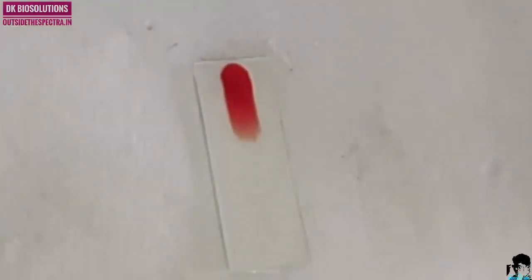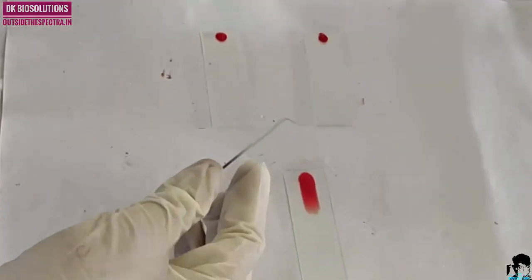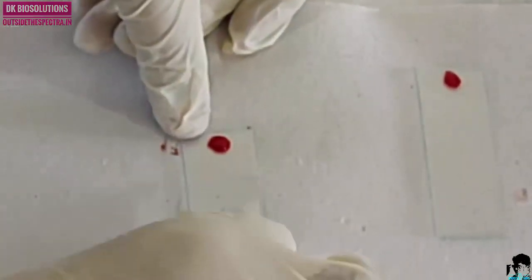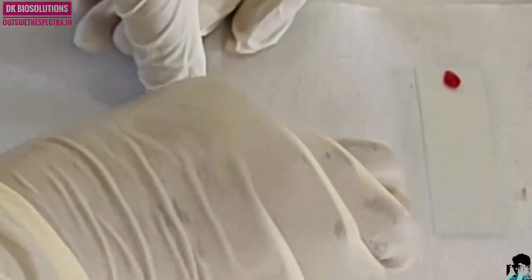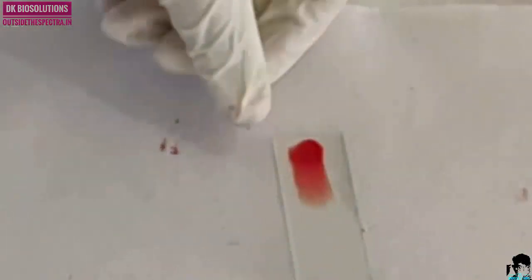To achieve a thin layer of blood, maintain a 45 degree angle in between spreader and blood slide. Now, you will get uniform blood film in a tongue shape nature.